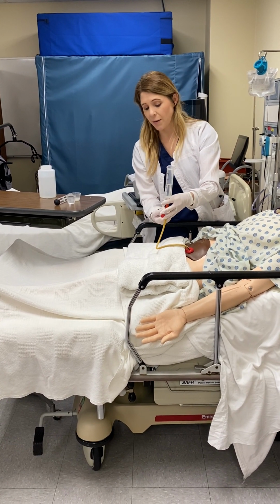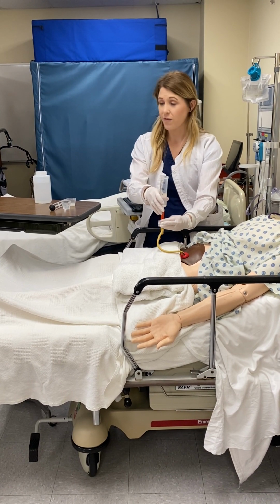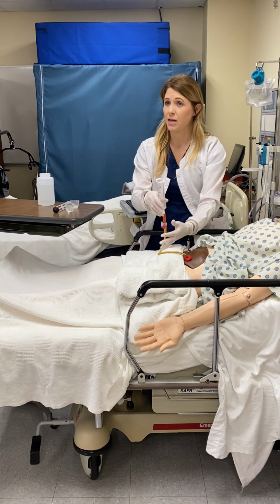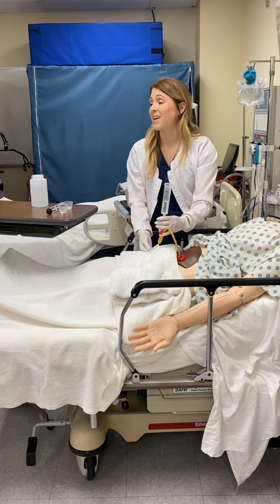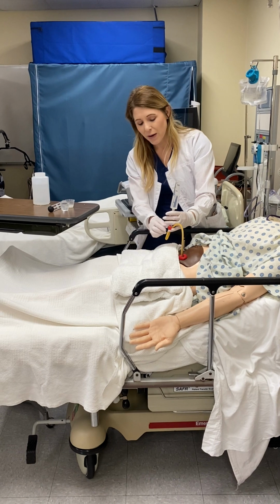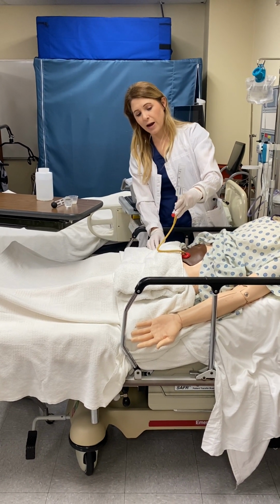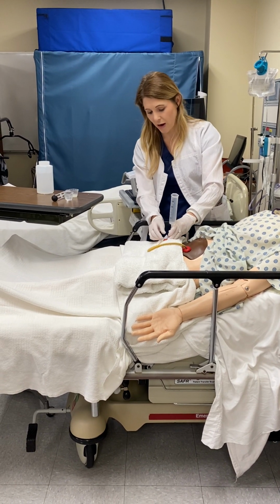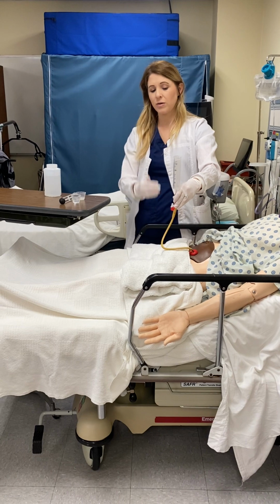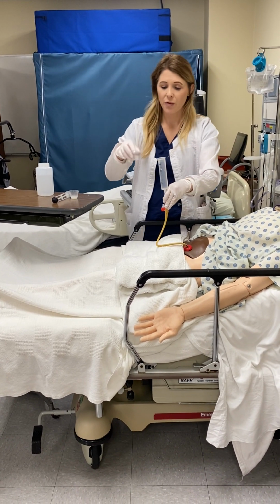So I've got the stopcock on this one. Some patients don't have a stopcock, and I've got to use my pinky finger to keep clamping, going up and down as I clamp. Okay, so it's just by habit that I still do my pinky like that. But anyhow, I don't have to. I can just open the stopcock, raise it up with gravity, and as it comes down, I don't want him to get air, so I'm going to come down with gravity, turn my stopcock off so he doesn't get air. So I got him 30 mLs of flush.